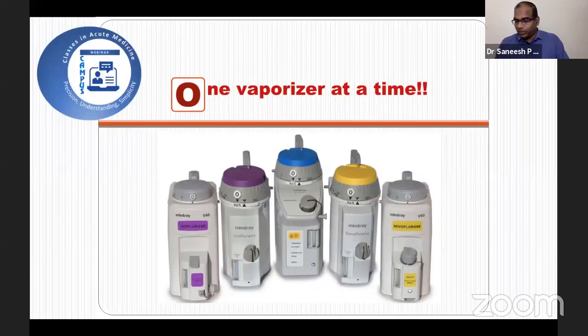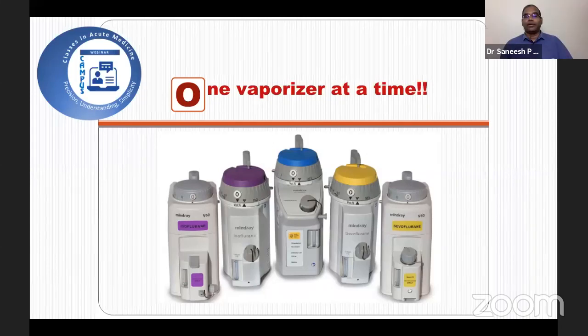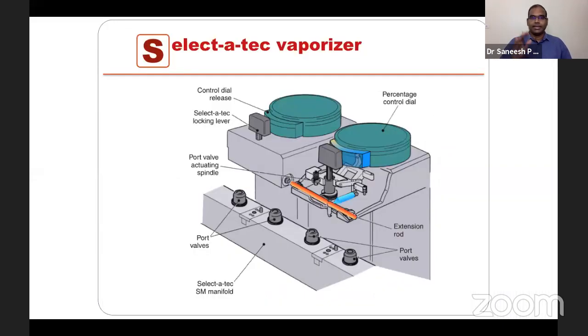Now who is helping me to describe how we avoid using more than one vaporizer at a time? What are the mechanisms? Vaporizer interlocking devices. Interlocking systems. First, which one do you want to discuss? Selectatec or Dräger interlock? We'll discuss Selectatec. Simple, no? Selectatec vaporizer. Clear? You have seen the extension rod in the vaporizers? Yes, sir. I have highlighted it in orange.